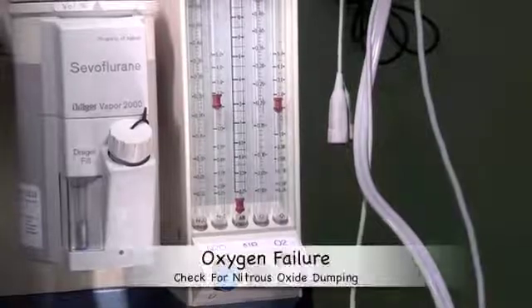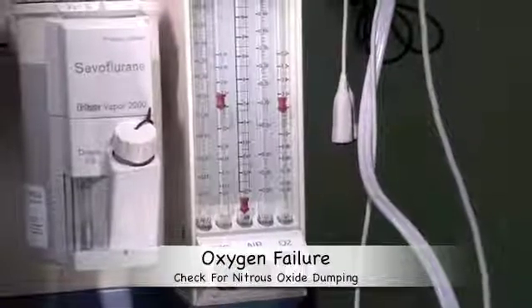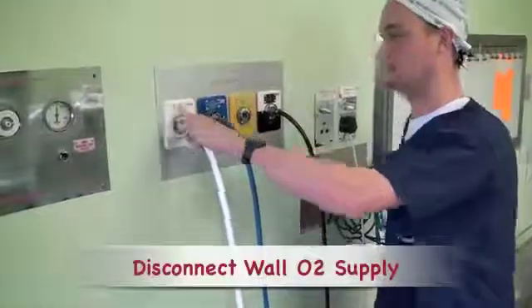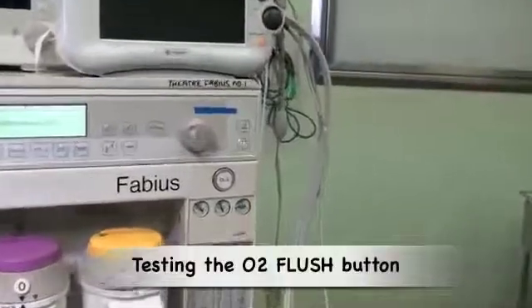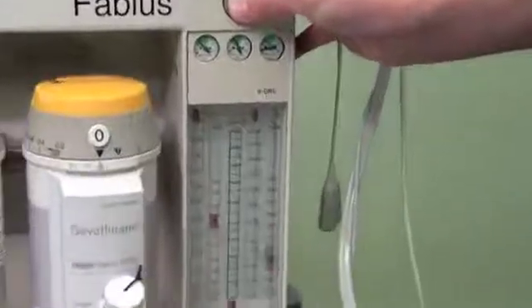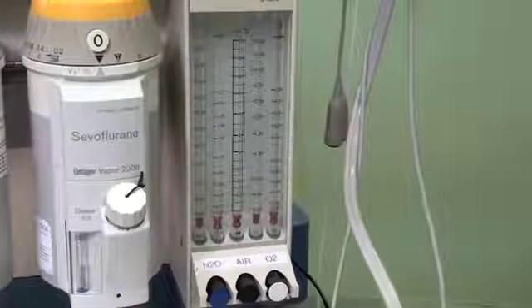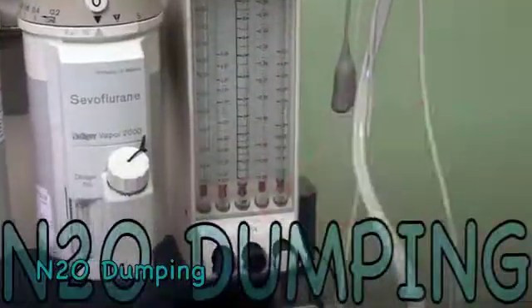In the event of a failure of the oxygen supply to your machine, it is essential that the nitrous oxide supply is also stopped. This can be tested by disconnecting the oxygen supply from the wall, then pressing the oxygen flush button to empty the machine of oxygen. One can now see the machine alarming because the oxygen supply has been terminated and the machine has dumped the nitrous oxide that was flowing.